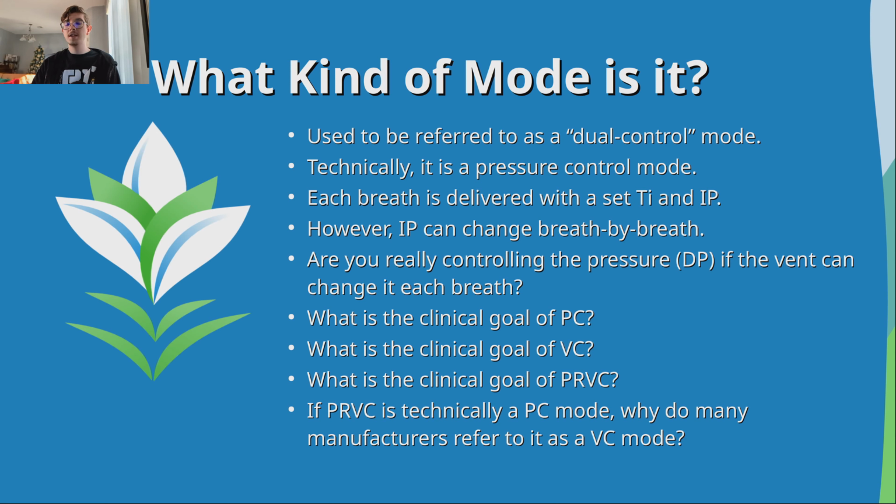You can limit, once again, the driving pressure with your high pressure limit, but most of the time the high pressure limit is set by default to like 40. If you set your peak pressure alarm to 40, then it's 5 to 10 below that. But you're still talking about a driving pressure of like 25. You're still talking about a plateau of 30, which is acceptable, but that's a high driving pressure.